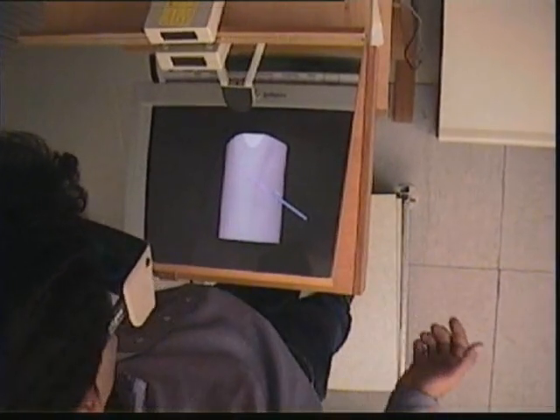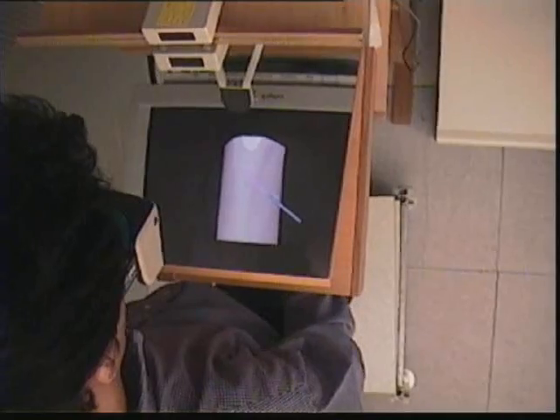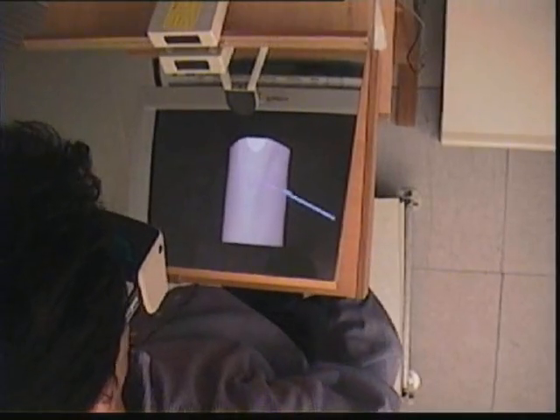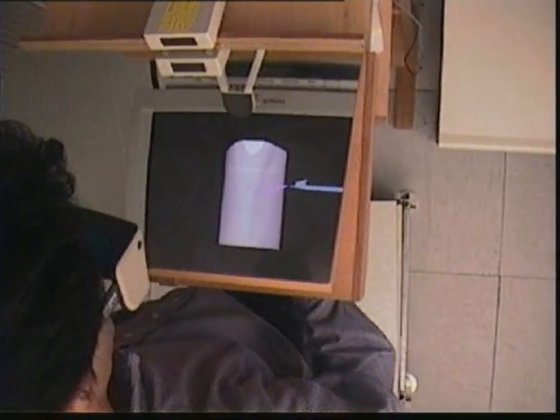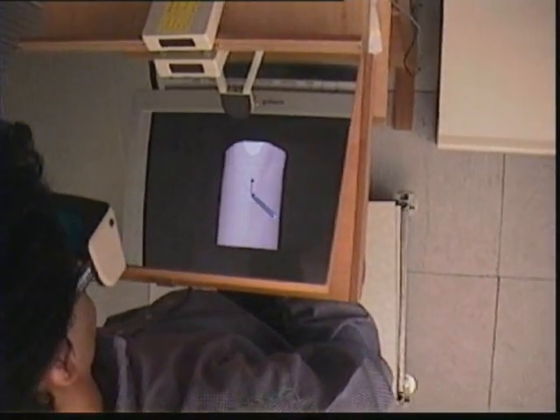Here, the surgeon can confidently seize the phantom stylus simply by looking at its virtual image.